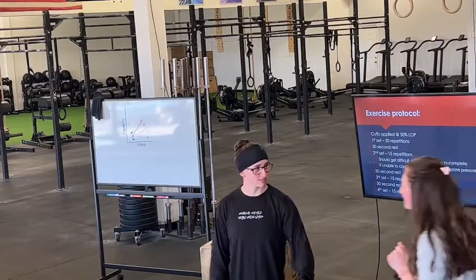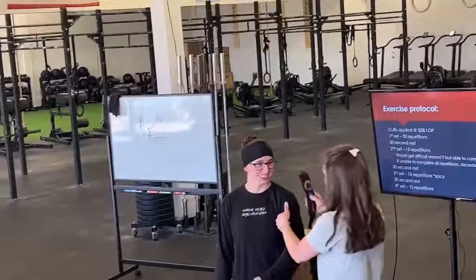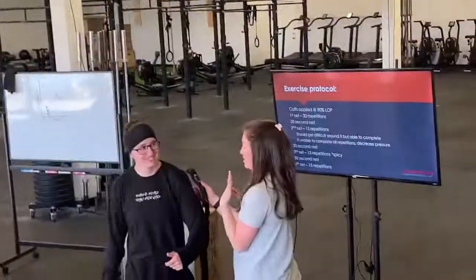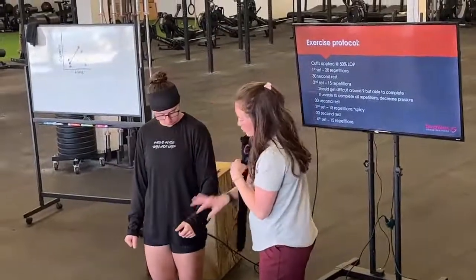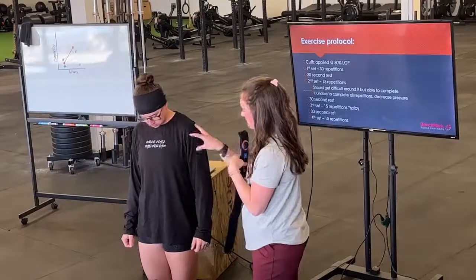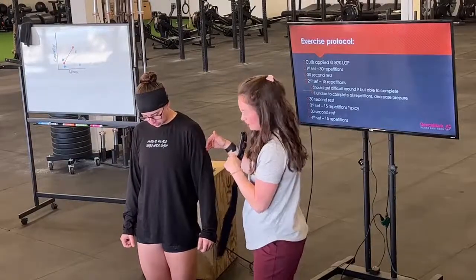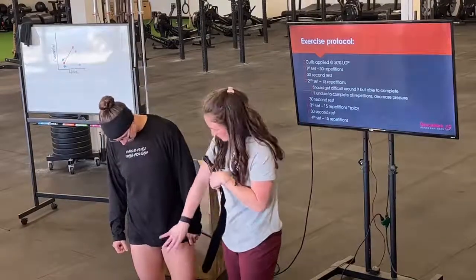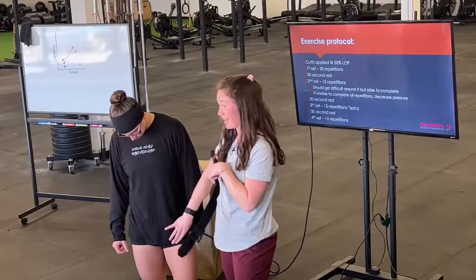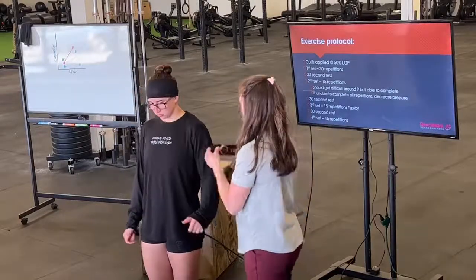First of all, any medical history that I need to know about? I don't think so. Okay, perfect. So there's two places that we will put this, okay? It's very simple. If we're treating an upper extremity injury, we're gonna apply it proximally to her shoulder to cut off that brachial artery, right? If we're treating a lower extremity injury, we're gonna apply it very proximally to her thigh to cut off the femoral artery. So those are the two main arteries that we are occluding.